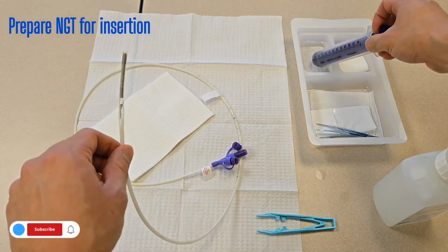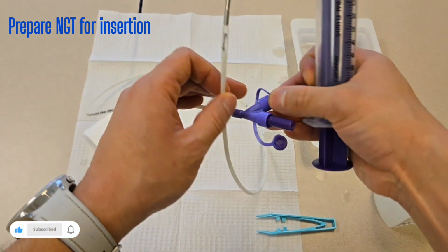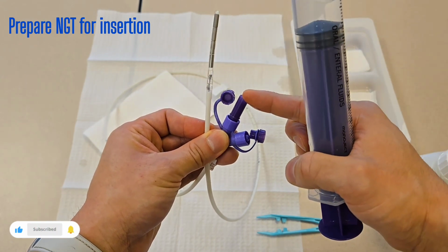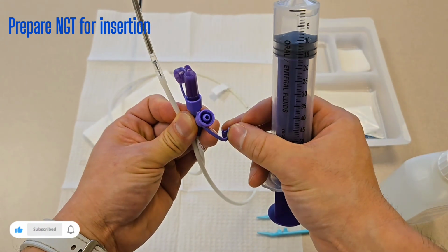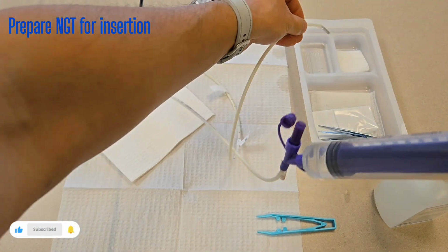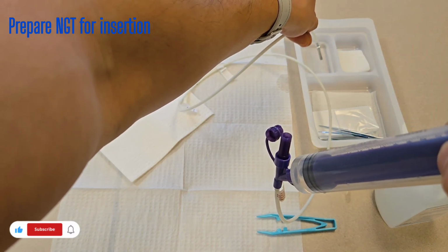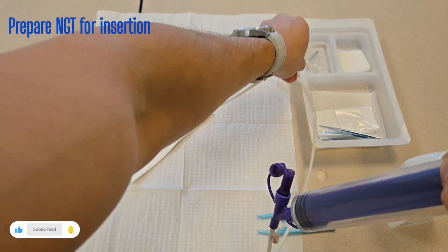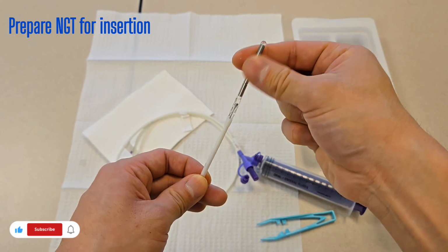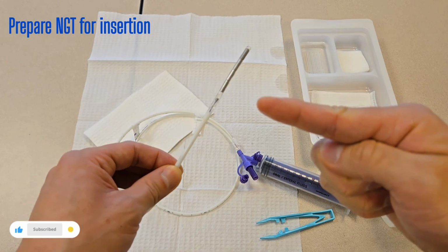So let's start by flushing it first with 10 milliliters of sterile water, and you're going to notice that the tube comes in already with 2 ports. This one here already has the metal guide wire, do not remove it. The other port that is open on the side, this one will be for you to twist it on, and you're just gonna flush it and watch as we start to flush and irrigate this. The tube or the tip is gonna be touching water. You can also submerge it into it, and you're gonna see that once this chemical touches water, it becomes very, very, very slippery. Okay, and this is how the tube gets lubricated.